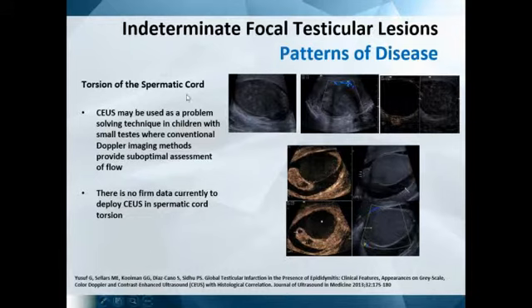Indications for using this: torsion of the spermatic cord. Now I must emphasize to you that torsion of the spermatic cord is a surgical emergency, and you should not really be doing ultrasound on these patients. However, there can be some problematic patients, or it may be missed and you want to confirm that the torsion has occurred. You may be fooled by the absence of colour Doppler. The technique may be not correct. You can't be confident that there is infarction in that testis.